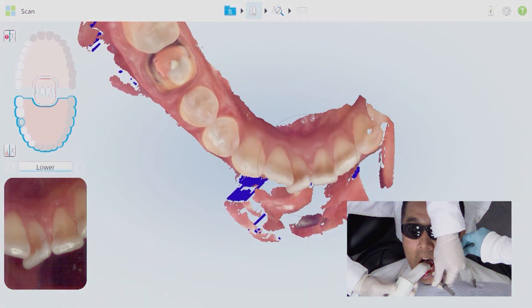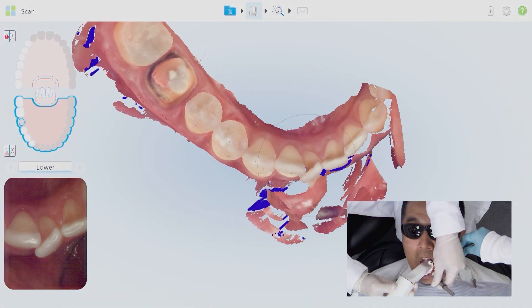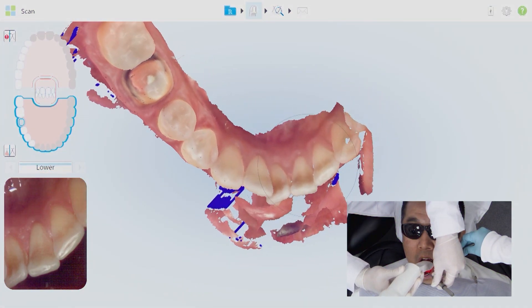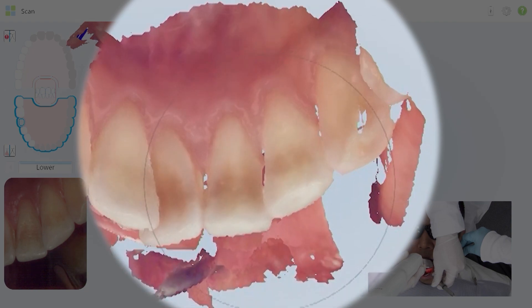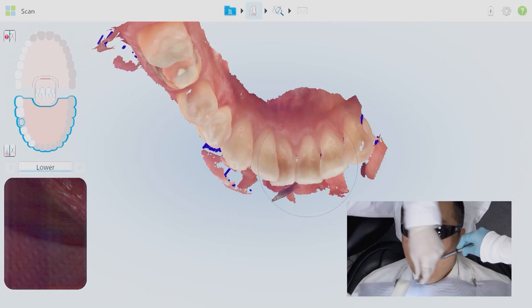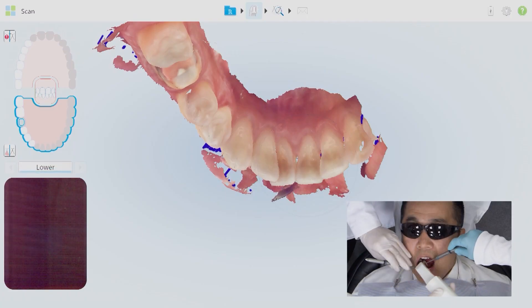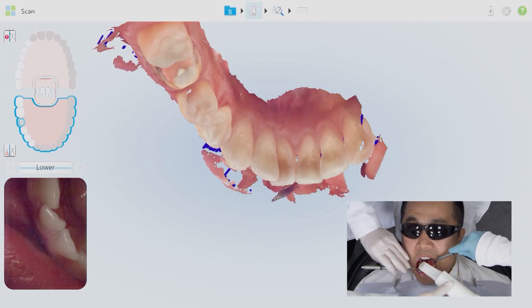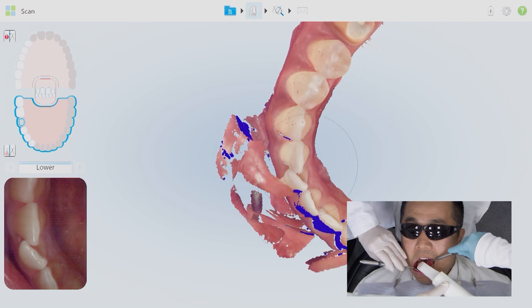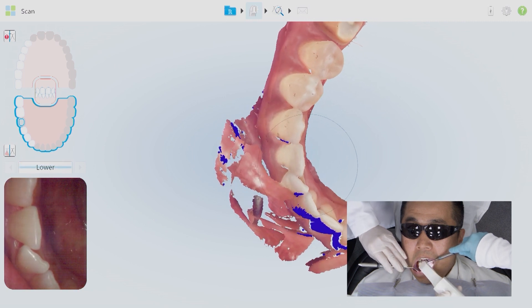I like to capture mostly from the incisal lingual first and build those areas, and then rotate to the facial. I usually finish the facial at the very last.